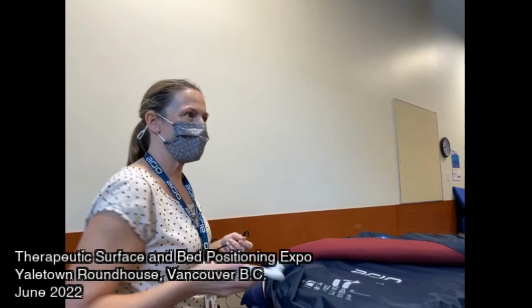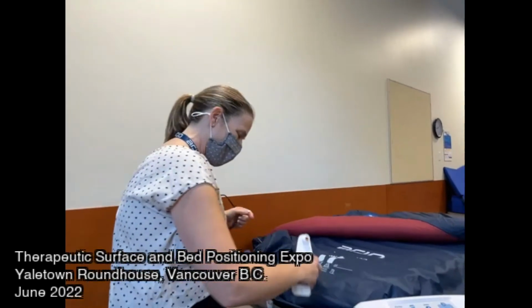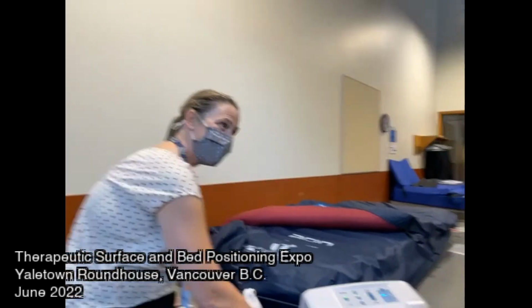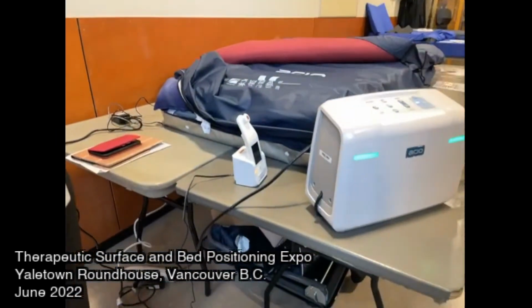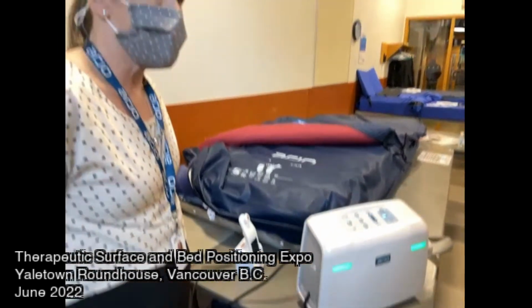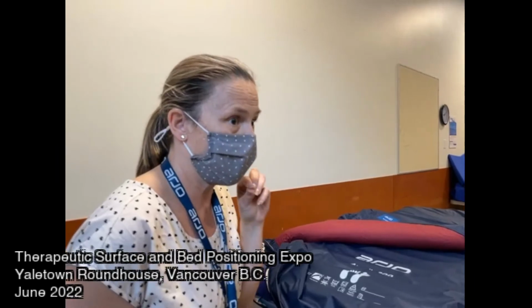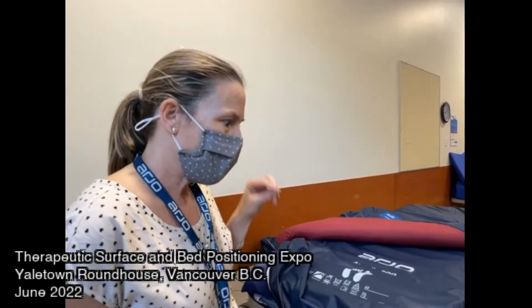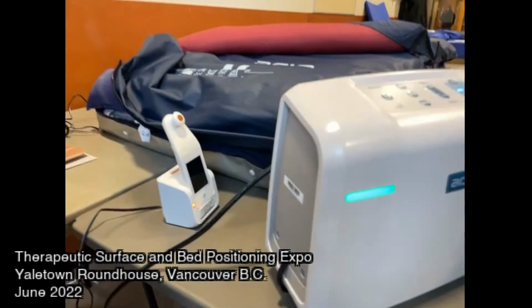Practice, people get so used to it, they just put it in their back pocket. Any questions about that? Yeah, I'm just curious, how does it work? How does it do it? Biocapacitance is the measurement of fluid subepidermally. So it's sending a signal down and receiving a signal back, and that tells it how much.